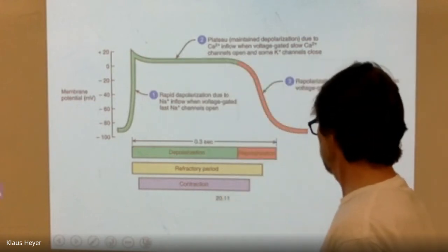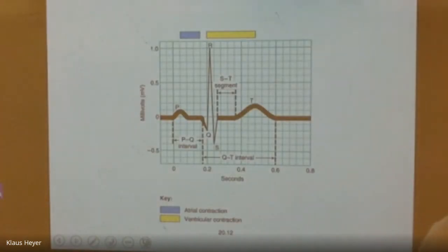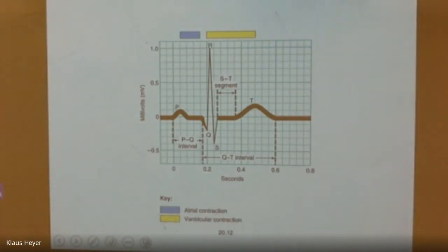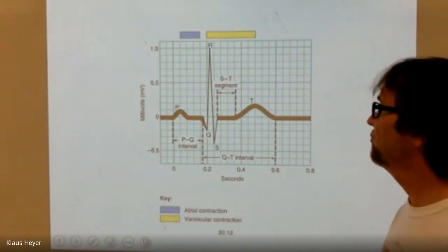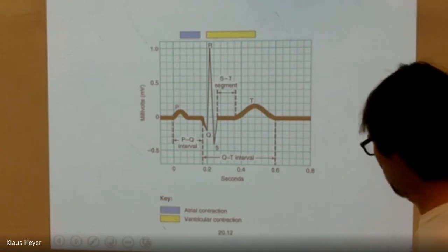Let's look at this more practically. So there is an EKG. An EKG is looking just at that. It's looking at depolarization and repolarization. And if you look at it, there's 3 parts.